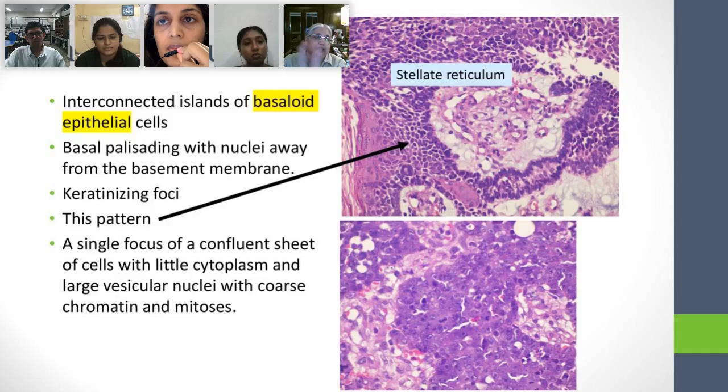Do you think, Kshitija, that this is a melanoma within an ameloblastoma? Does it sound very likely? No. So now, Neha? Ma'am, ameloblastic carcinoma. Ameloblastic carcinoma. Excellent. Neelam, do you agree?